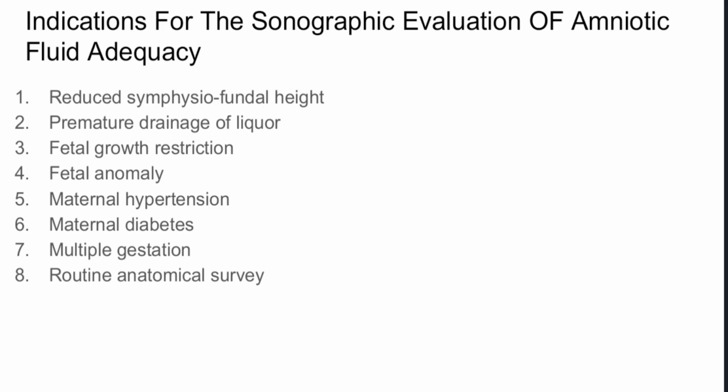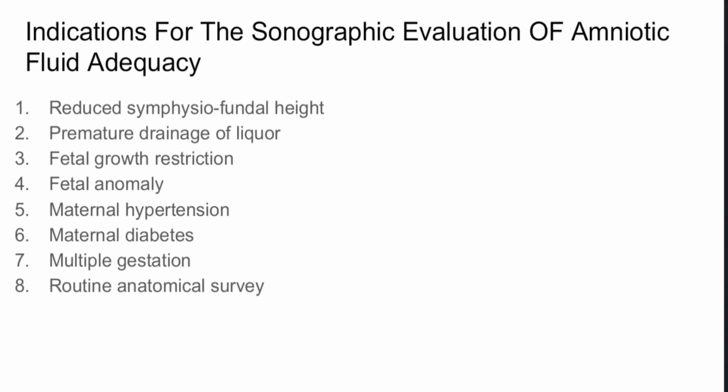Now, this may be because of one, reduced symphysiofundal height. When in an antenatal session, the midwife or whoever is the care provider notices that the fundal height is reduced, they may want to evaluate the amniotic fluid.